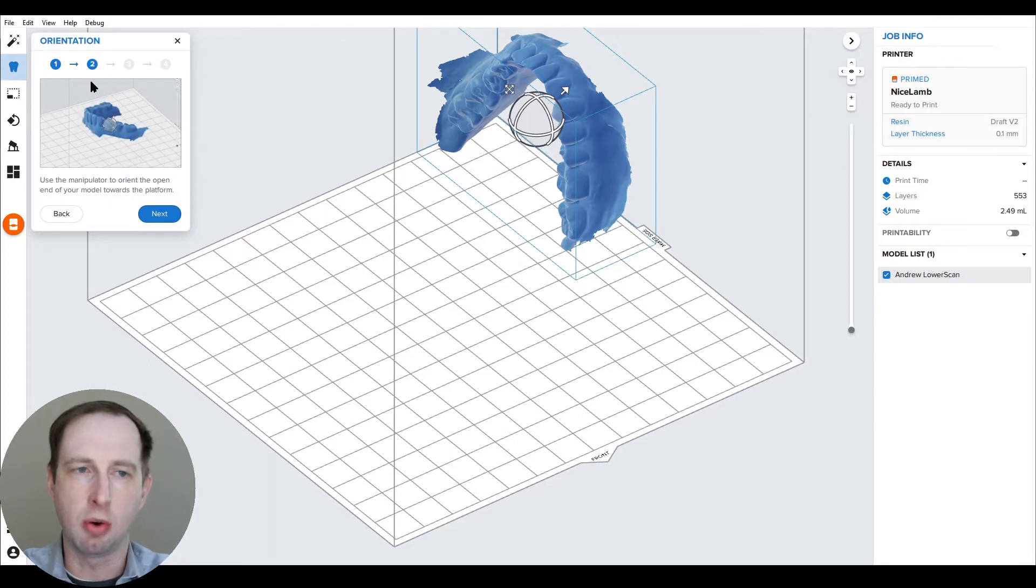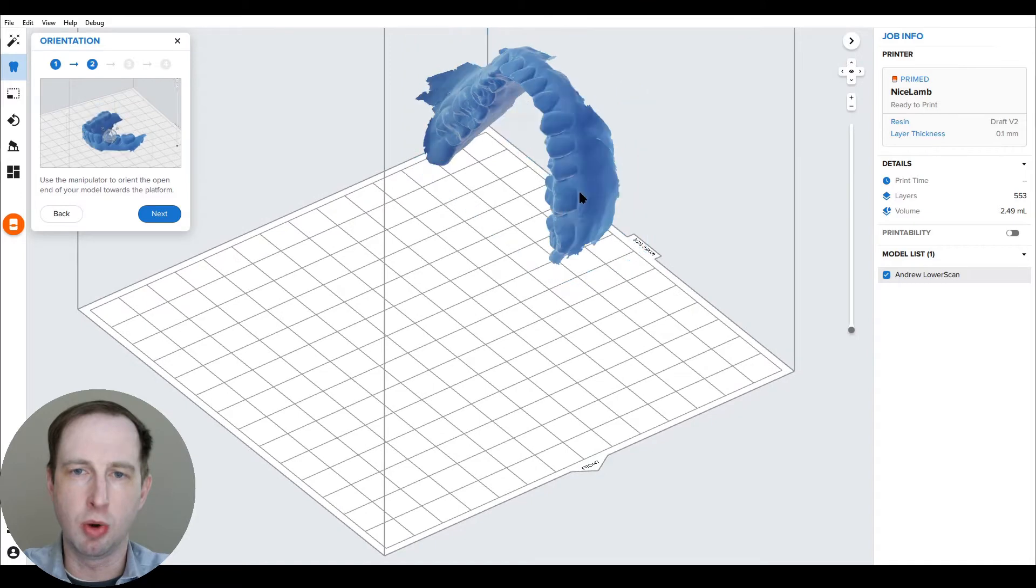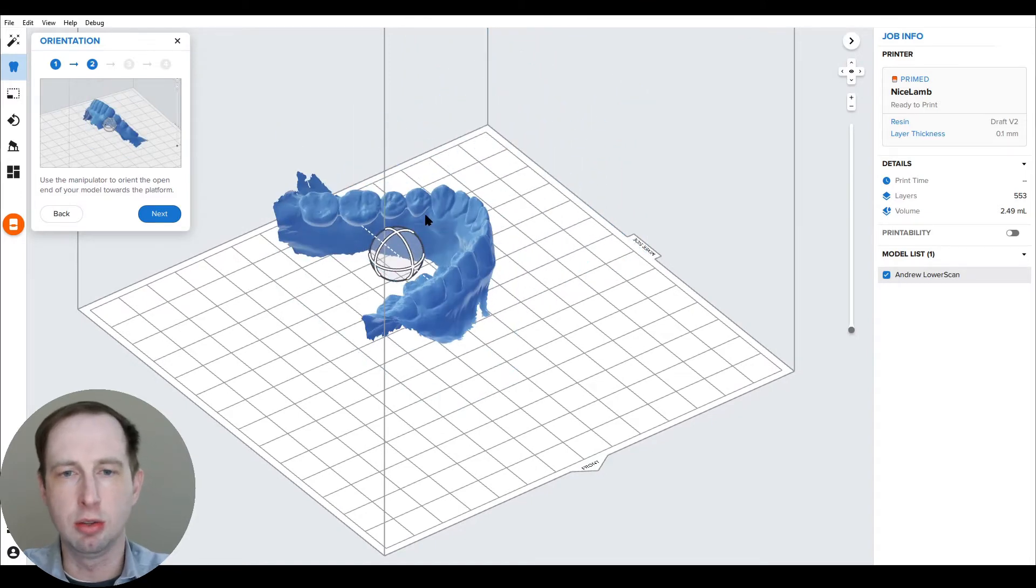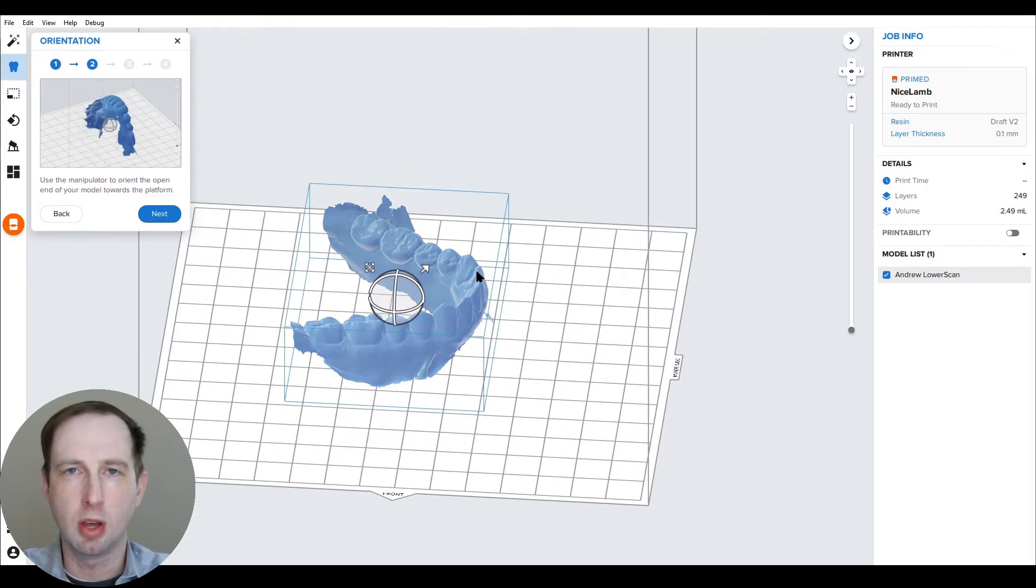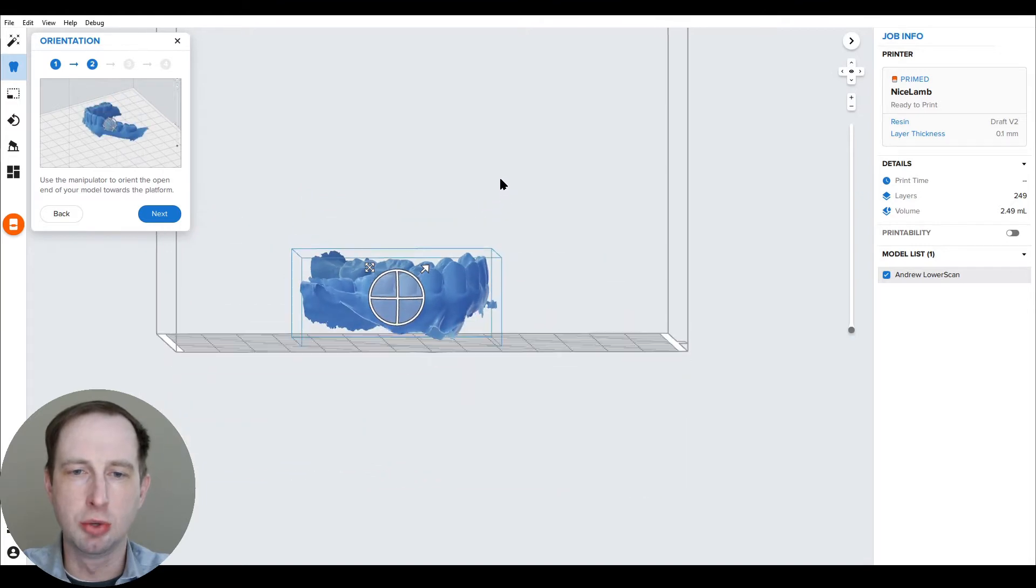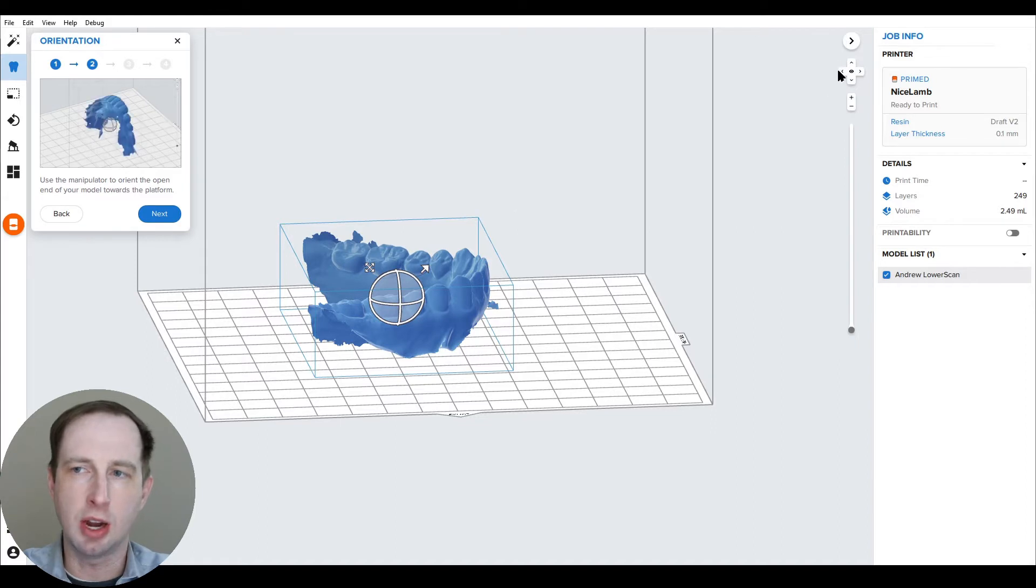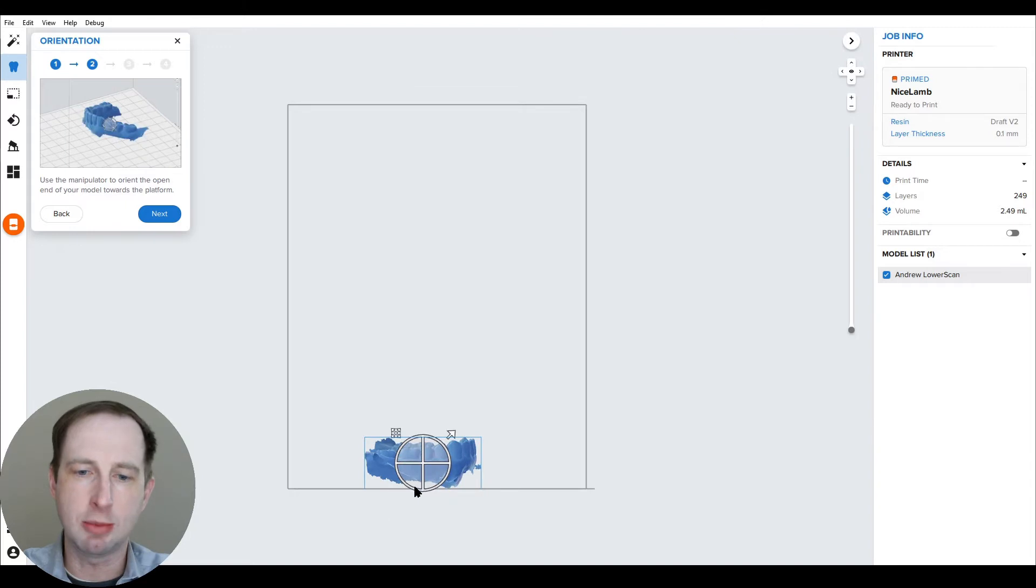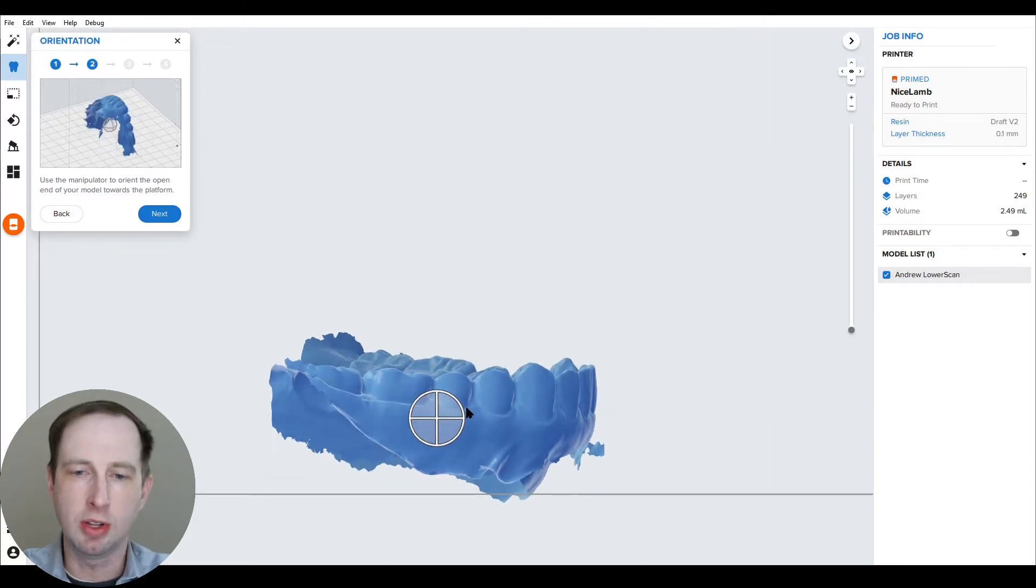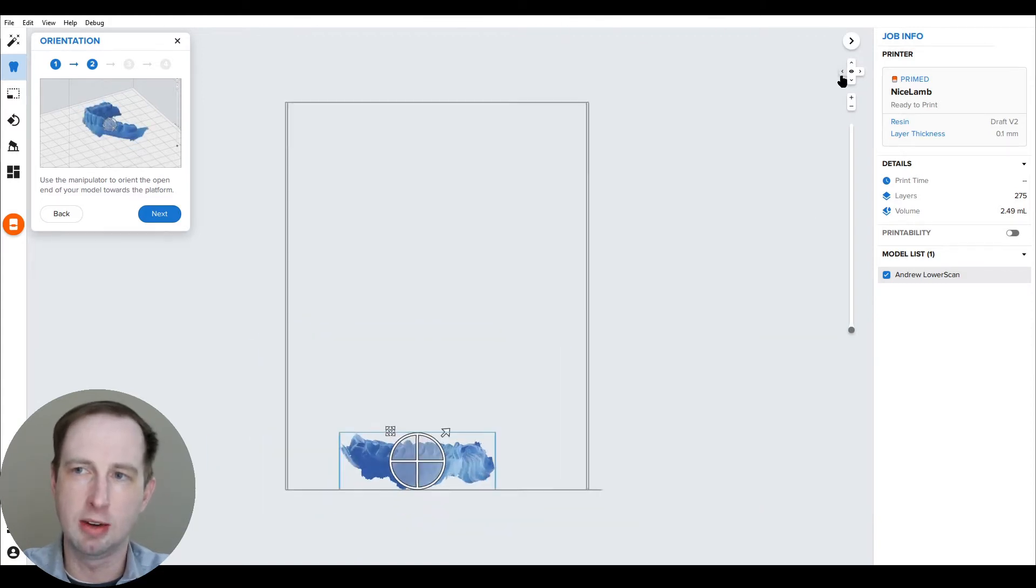Now we have the lower and the tooltips instruct you what to do as well. But what you want to do is rotate this arch so that the occlusal surface is facing up and ideally the occlusal plane is parallel to the build platform. One way to make that easier is I really like using the view tools in PreForm over on the right hand side.